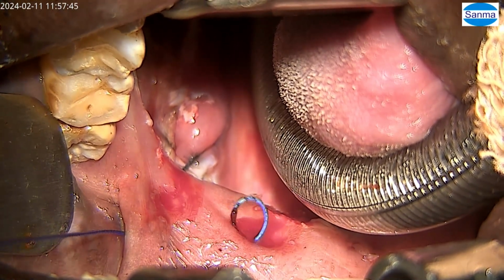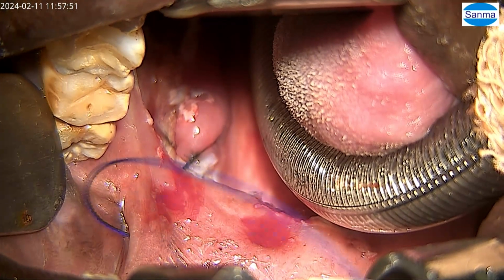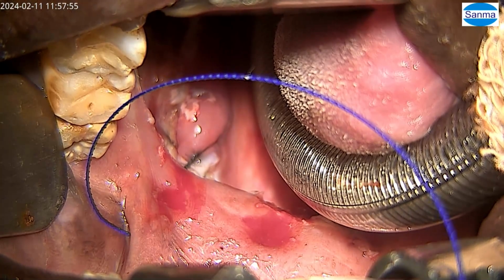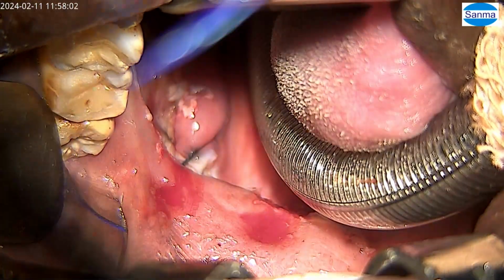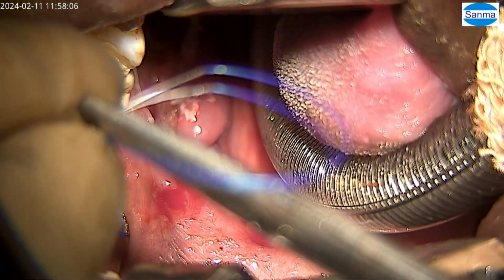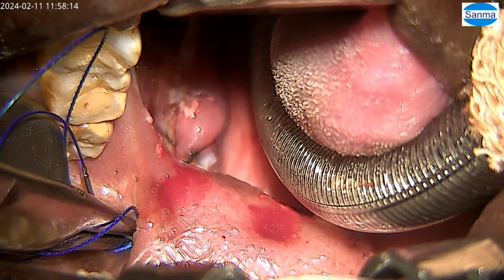Now you can see the non-absorbable. I have come lateral to the raphe. Can you see that? Now I'll go from left to right. So this is exclusively for AP collapse. This area is below the action of the levator palati. So I'll go from right to left. I have already come, and now I'll go from left to right. Again take a U-turn and cut it off. What is important is to put it right in place.